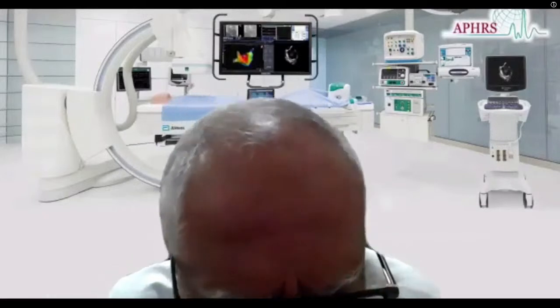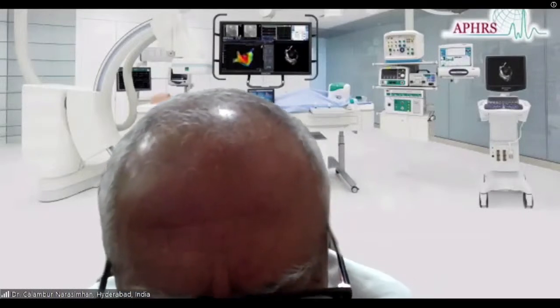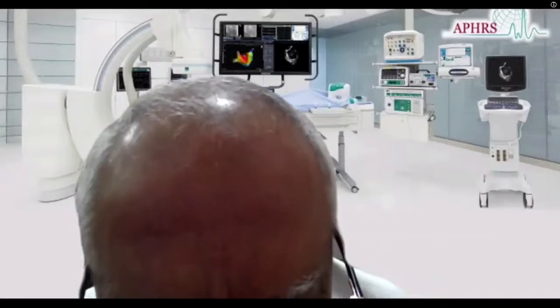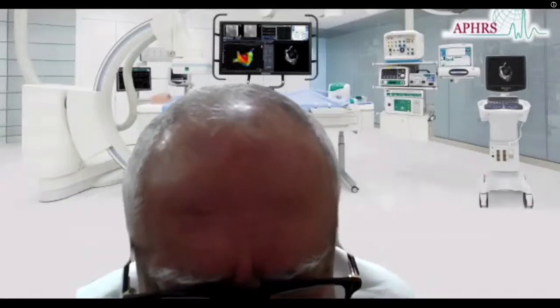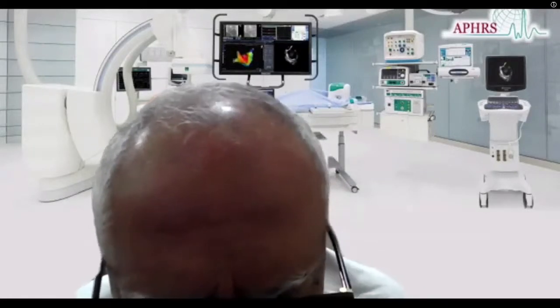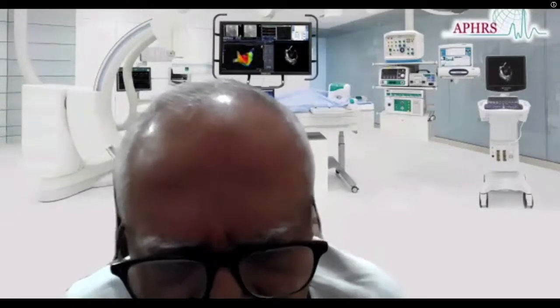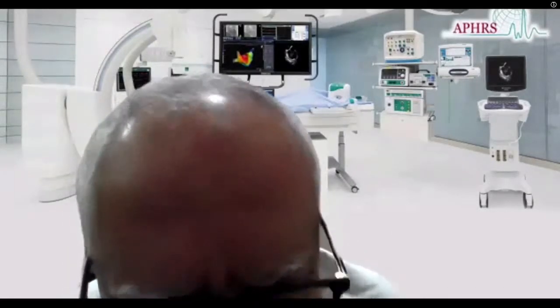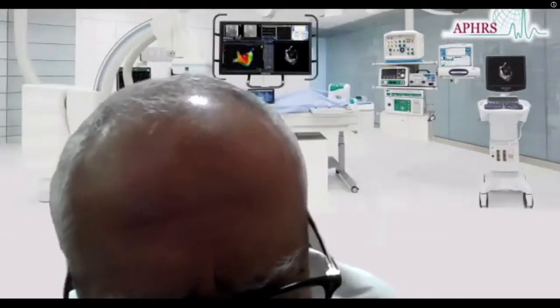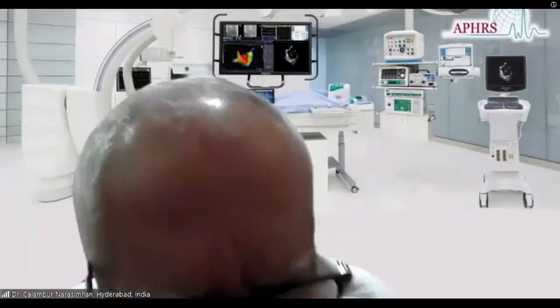Now, if you are left a little confused, the best thing to do is deflect your catheter and do the overdrive pacing from close to the tricuspid annulus, because when you do that, you are exaggerating the difference between AVNRT and septal accessory pathway. So do a ventricular overdrive by deflecting the catheter and placing it at the base of the ventricle, close to the annulus. If you do this in a septal accessory pathway, the return beat will be much shorter, and in AVNRT it will be much longer. So this will exaggerate the difference.